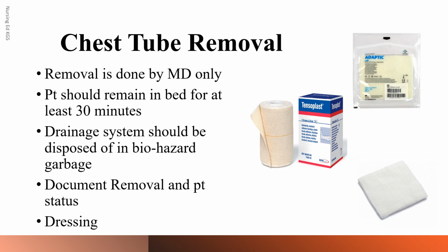Some physicians will order a chest x-ray within 4 hours of removal. You will just have to follow up with the physician to ensure that they have reviewed this chest x-ray, and you will document in the patient's chart that the chest tube has been removed, the patient's status. You'll also note the final amount of chest drainage to calculate the total drainage.